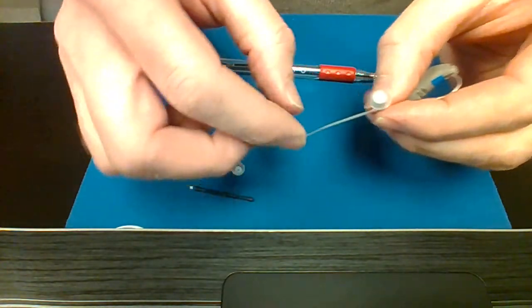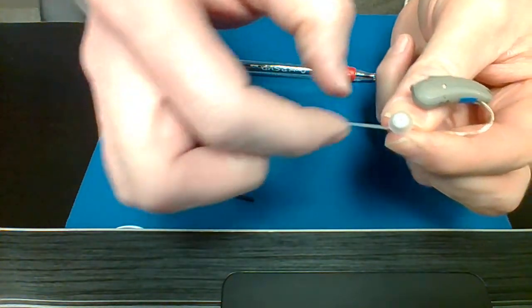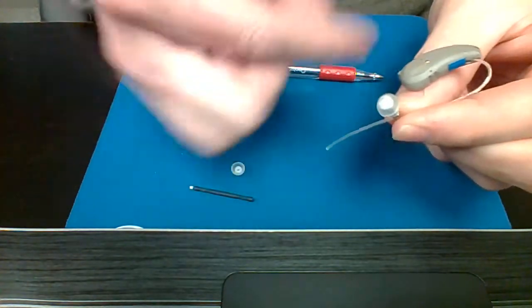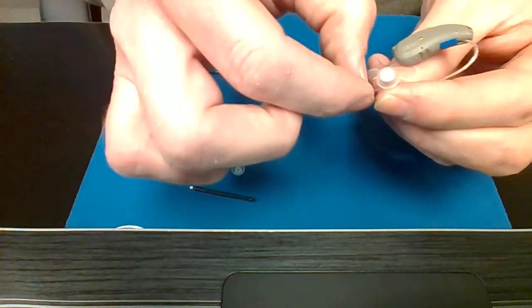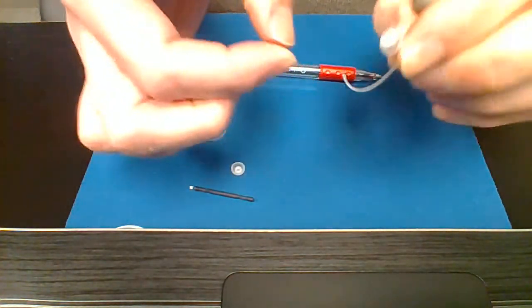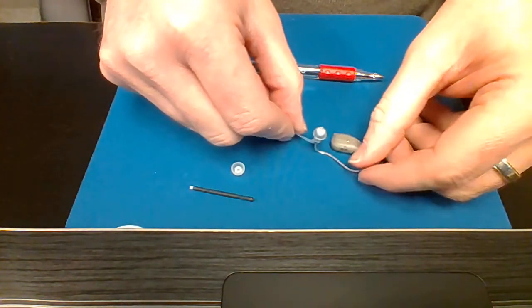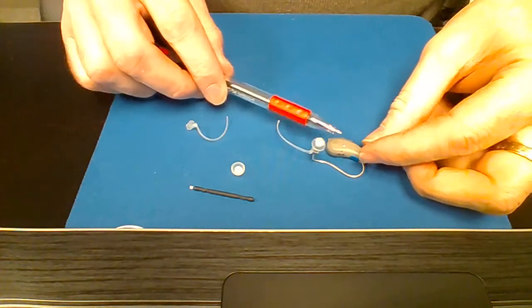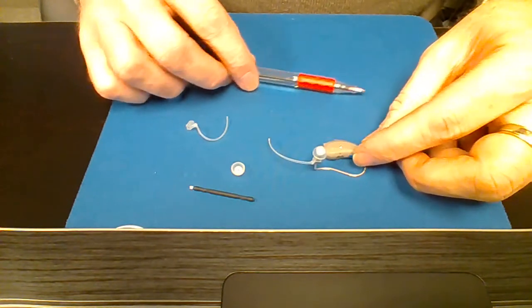The last thing is you may want to curl this to make it more comfortable when you go to put it in your ear. So you will always want to curl it back towards the hearing instrument, and I just take and pinch it like a Christmas ribbon between my fingers and give it a good pull, and it curls up just a little bit. And that's how to change the dome and the wax filter and the retention wire on a Rexton behind the ear receiver in the canal hearing instrument.